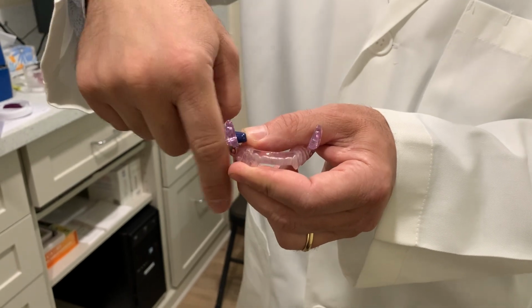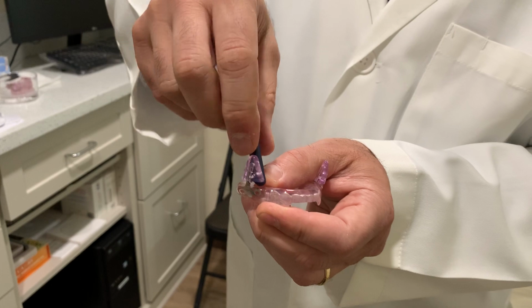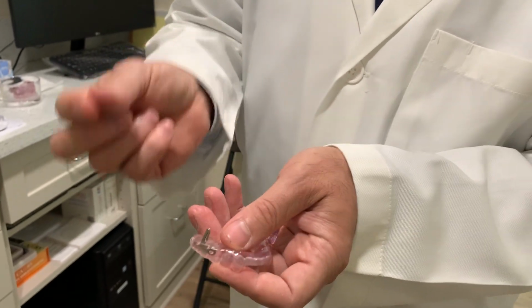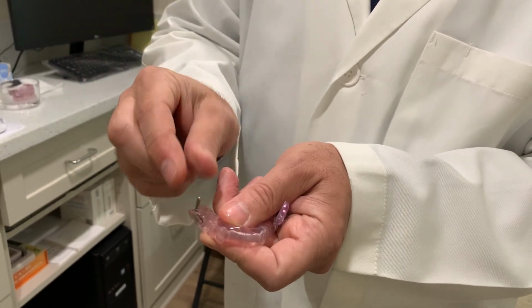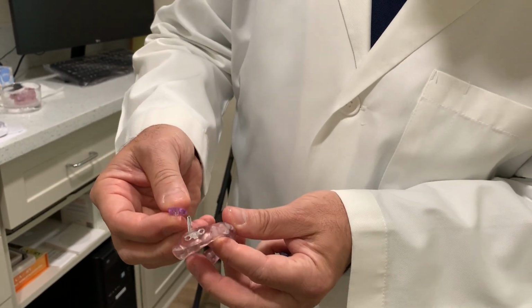Once I stand this key up, that little wing is gonna raise up. And now once it's up, I will pull it out, take another number higher, snap it in place to move the jaw forward. So you're gonna take a look at it.